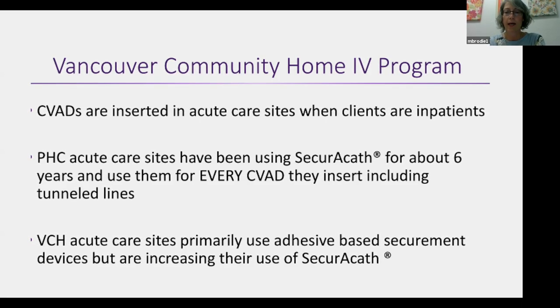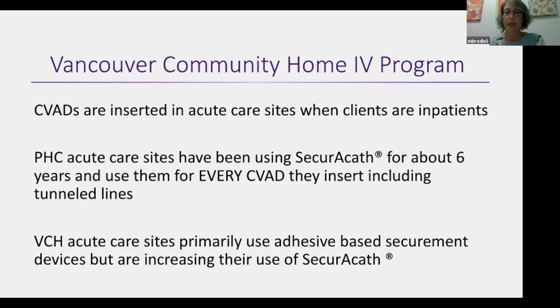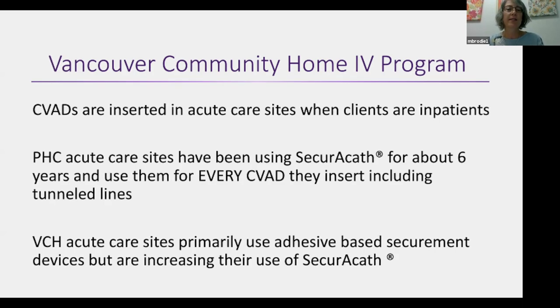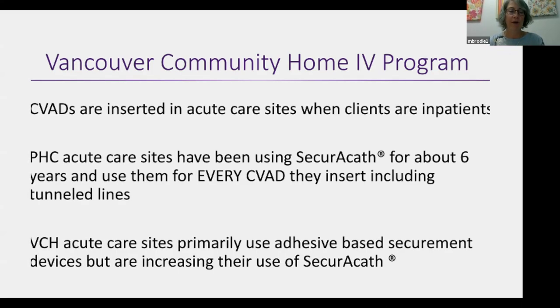move toward that. So we've been seeing the SecurAcath in community for about 6 years, and the nurses who've been here in that time have really gotten used to it. Even though Vancouver Coastal still uses some adhesive-based securement devices, when those clients come into community with their PICC lines and these devices, with the first dressing change in community, we remove the adhesive-based securement device and just use a securement dressing as our primary method of securement. So we are either using just the dressing, or we have a SecurAcath and using the securement dressing.